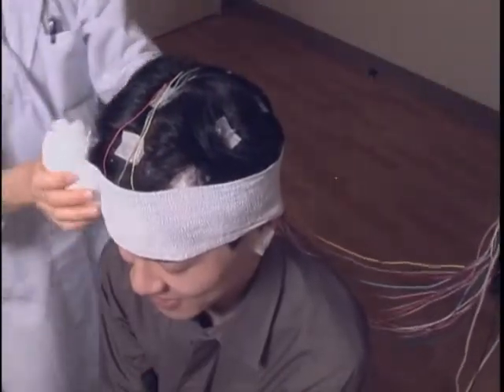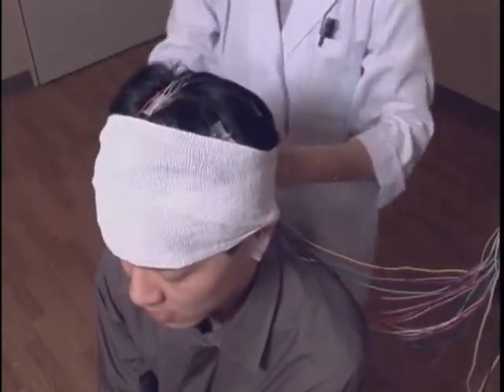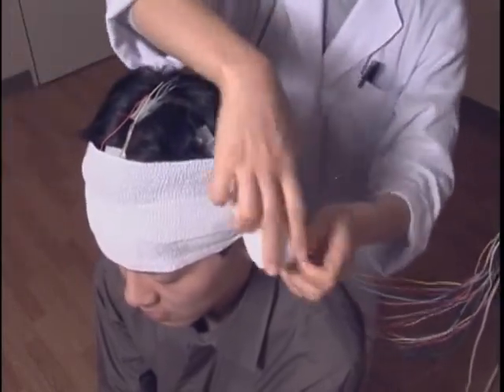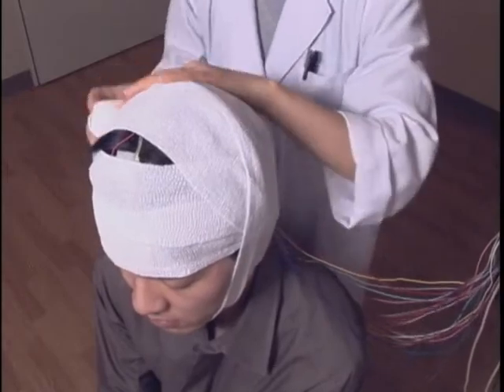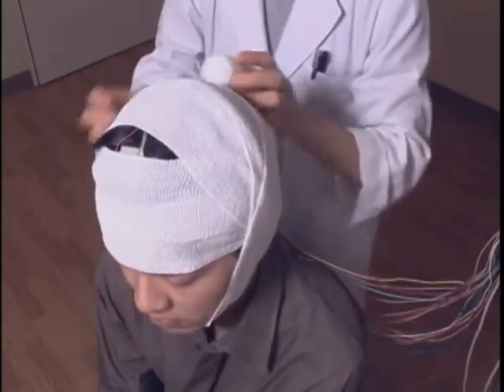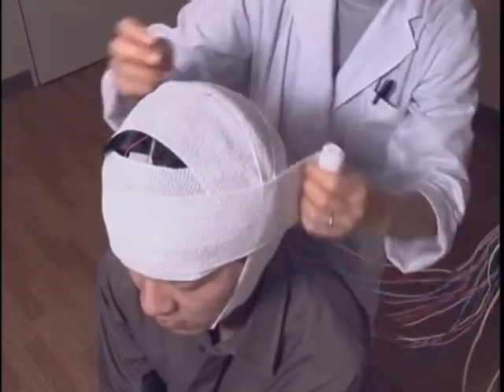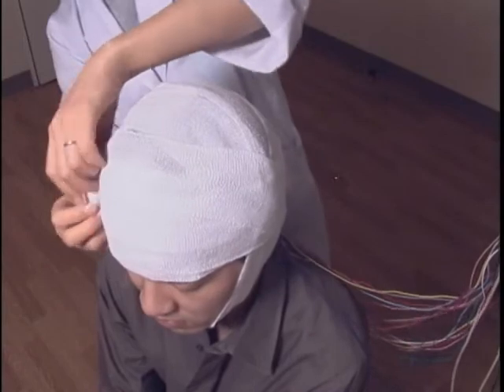When the subject moves vigorously or when EEG is to be recorded for a long period of time, after confirming that the electrodes are in good condition, use a surgical dressing to further secure the electrodes. But this procedure is not needed in ordinary examinations. Then cover the dressing with the net and secure with surgical tape.